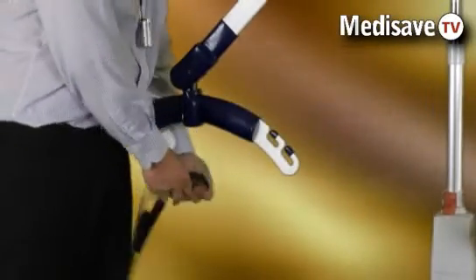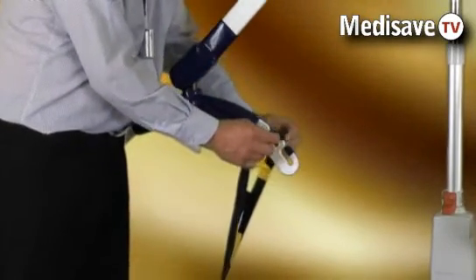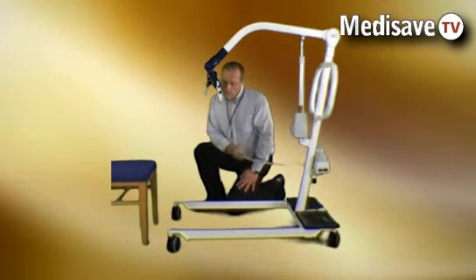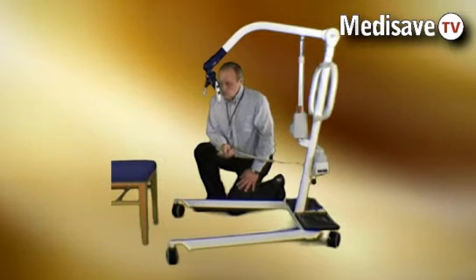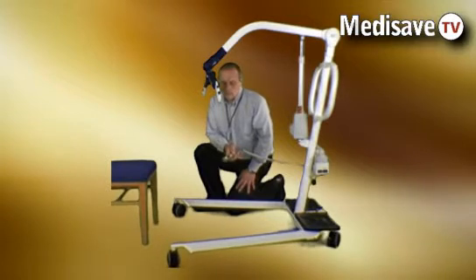The locomotor range of hoists uses slings with a loop type fixing which simply hook into the spreader bar. All locomotor hoists and standers feature electrically operated leg control, so to negotiate wide chairs or difficult access, the legs can be opened and closed.